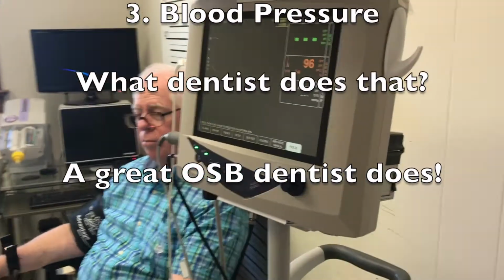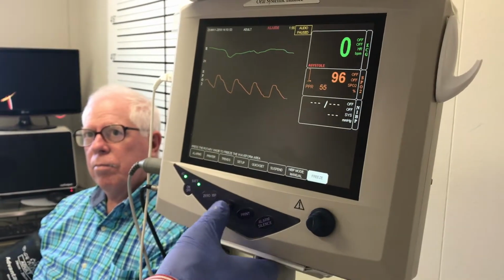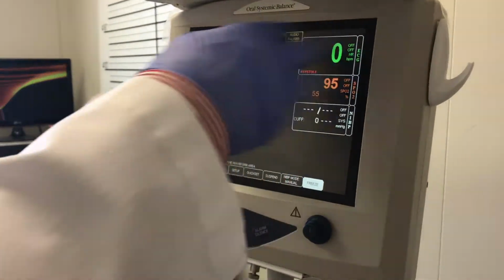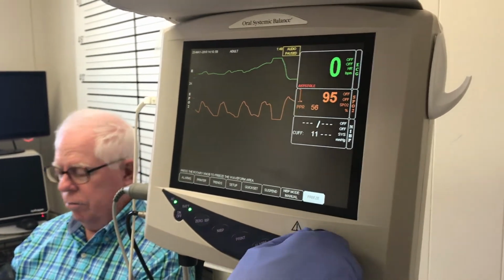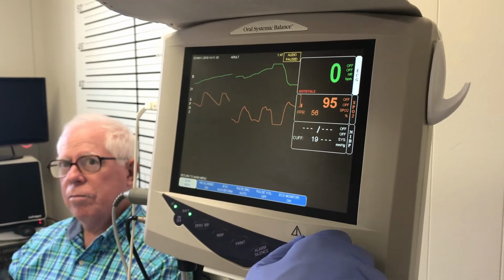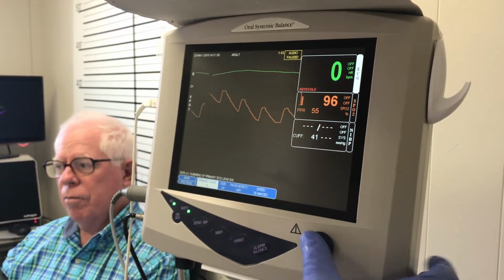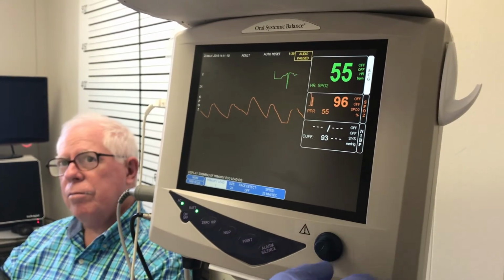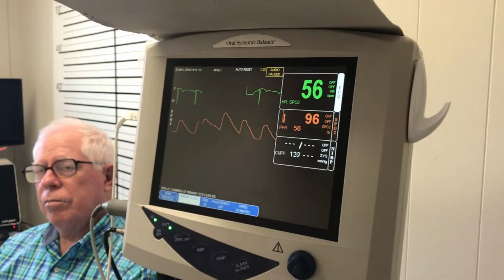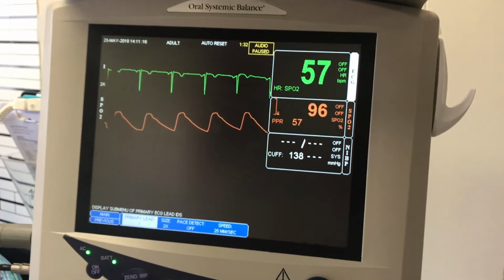So basically we're going to get a blood pressure because there's nothing on this tape yet as far as blood pressure. I'm going to change the leads, and we're going to go over that in a minute, about which lead to use for starters. If you get a blood pressure, pulse, and oxygen, you're doing more than most dentists.